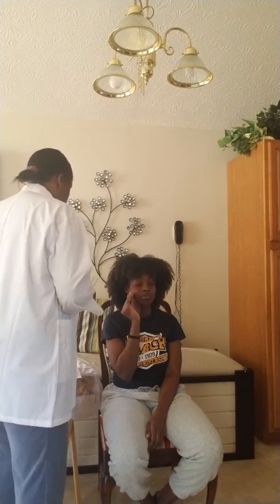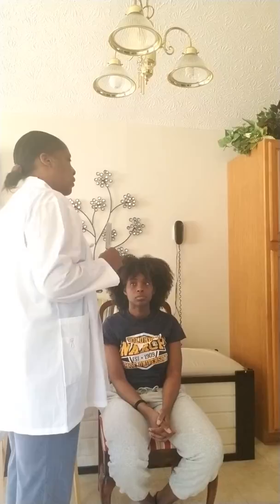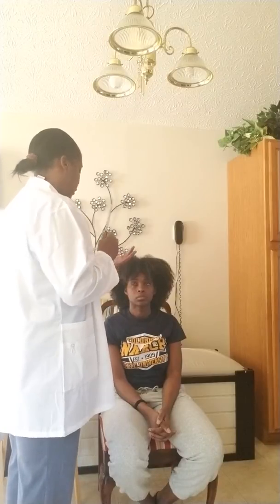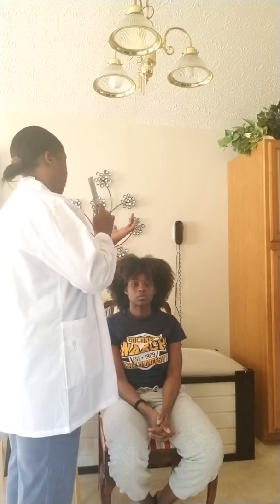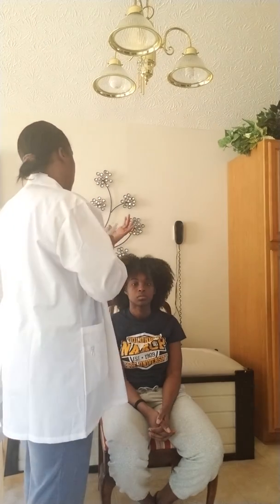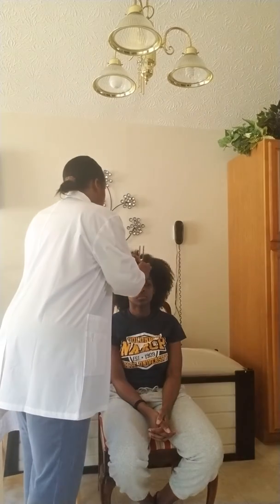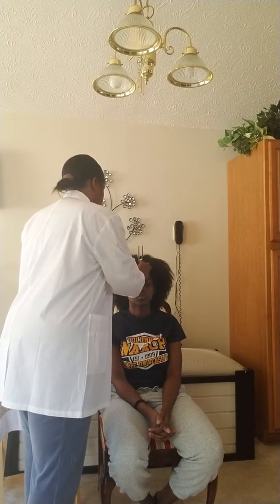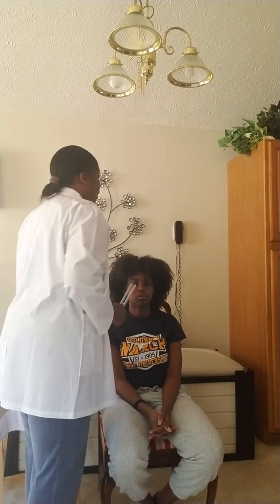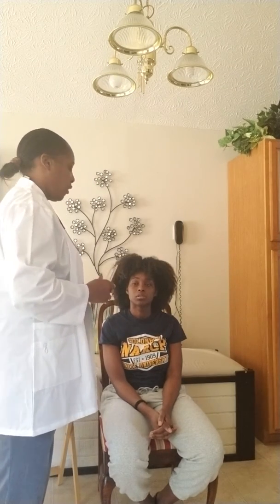Next I'm going to do the Weber's test. The Weber test tests for bilateral hearing through vibration and sound. Good. I can't feel it. Let me know when you can't hear it again. No. Okay. Did you hear it in both ears or one ear? Both. She heard it in both ears.